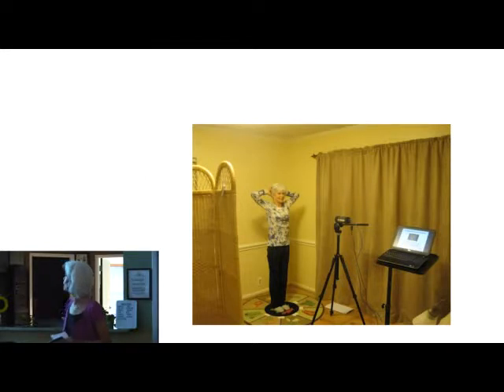And that's the front image that I'm facing, number one. And then there are six images I take of you: front, the laterals, close-up of the right and left, and a back image. The back can tell us about the front. There's no way to separate the breast from the rest of the body, and there's no way to separate other parts of the body and how they might affect the breast. And structure enters into breast health.